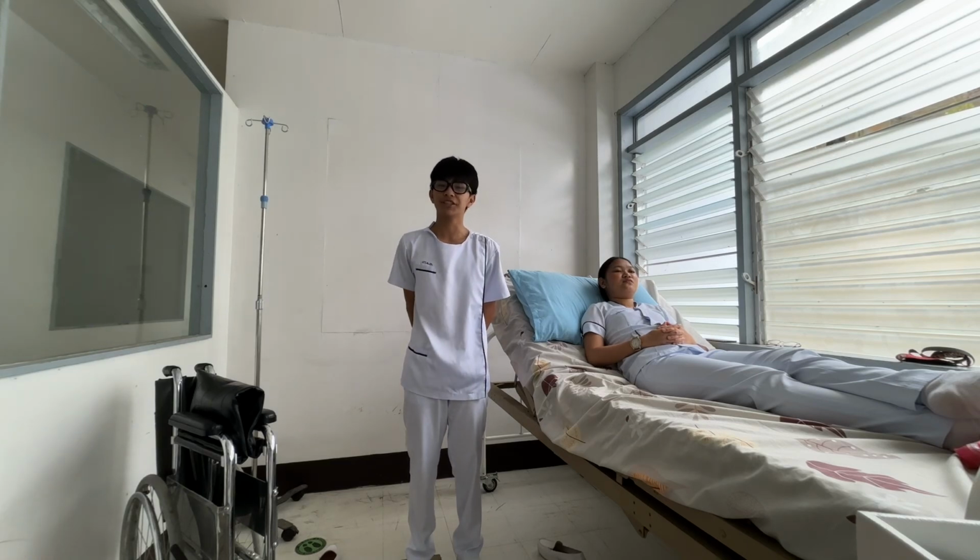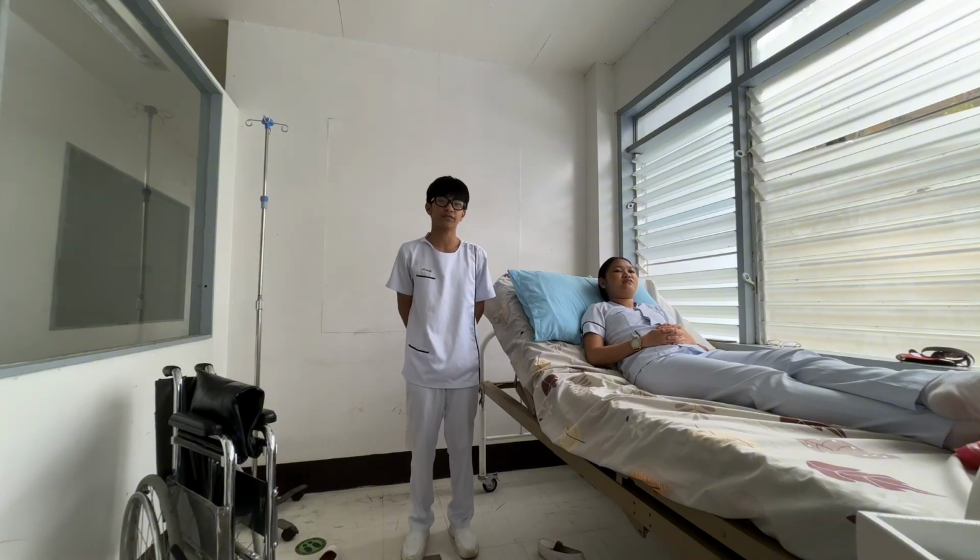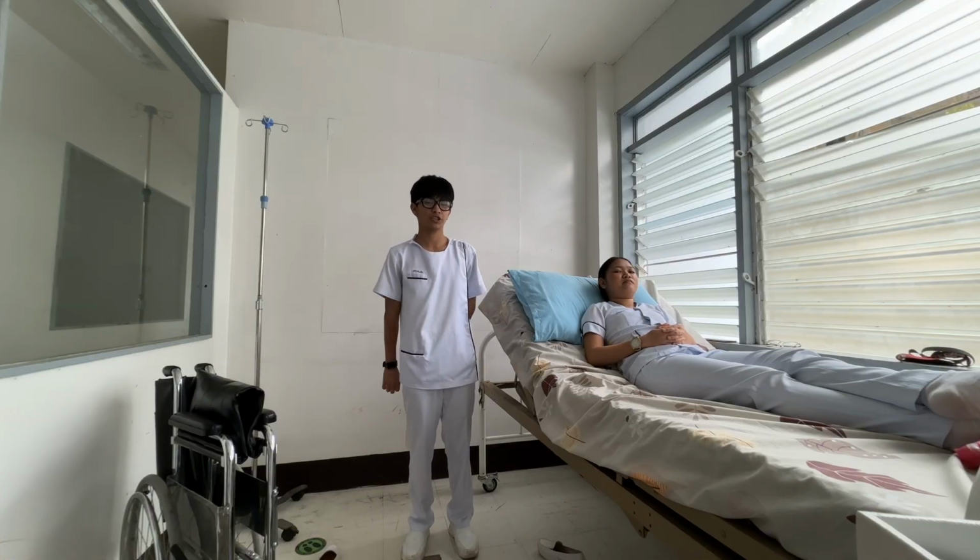Put the wheelchair right next to the bed at a 45-degree angle facing the foot of the bed. For a patient with weakness on one side, place the wheelchair on the strong side.